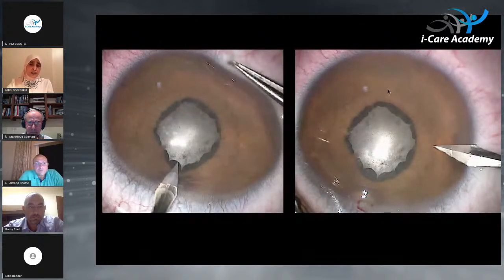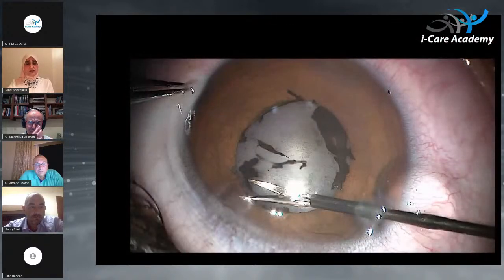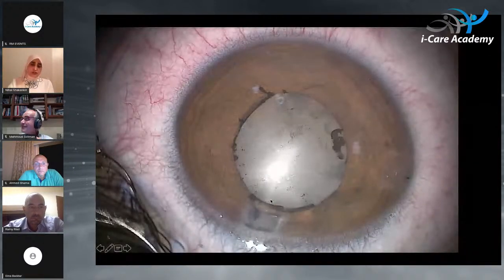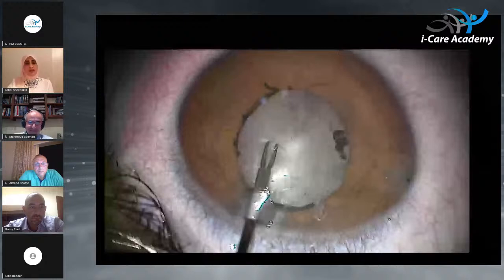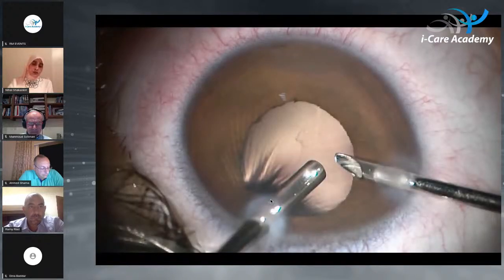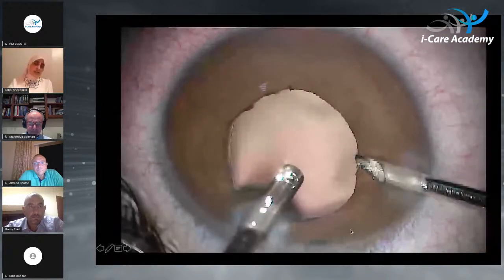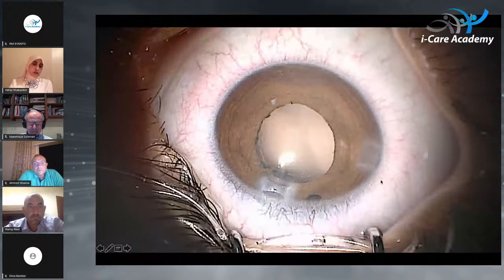So we go for clear corneal incision using an MVR knife, 20 gauge. And then we relieve the epilenticular membrane, and there is usually an epilenticular membrane that may be cut by scissors to dilate the pupil. And then we go for the rexis, and it should be not less than 5 millimeters or even more, maybe 6 millimeters. I totally remove the posterior capsule, perform vitrectomy, and perform a peripheral iridectomy. And here again, vitrectomy, and at the conclusion of surgery, you close these two tiny ones. It's a very simple surgery.